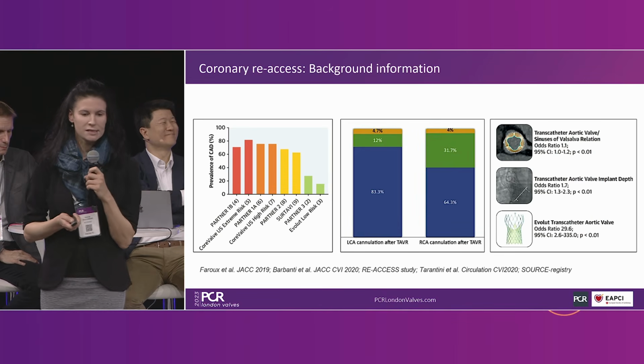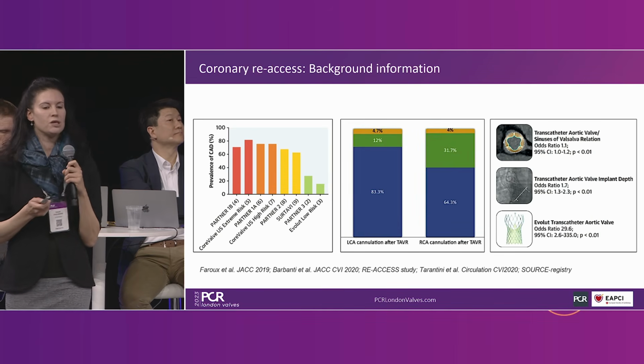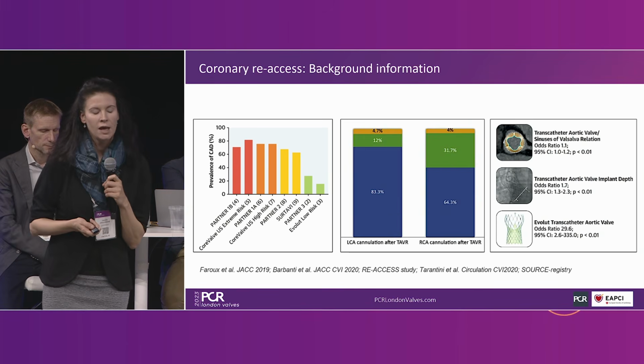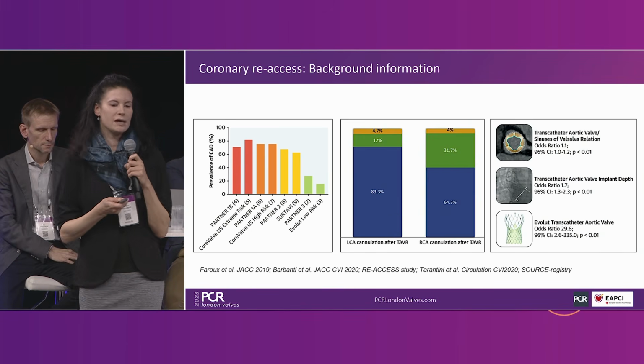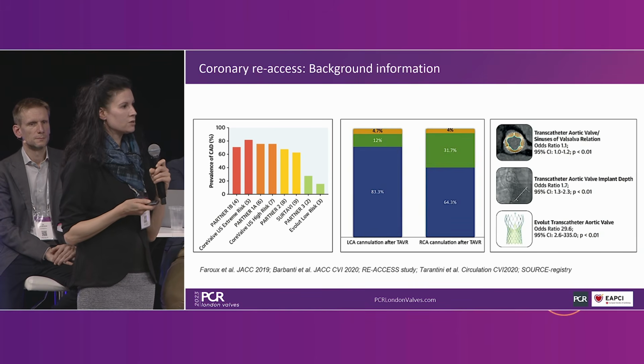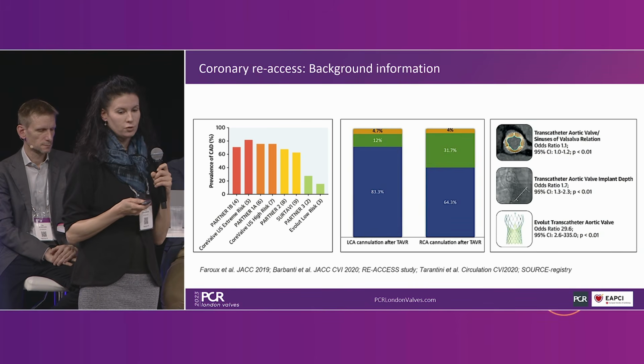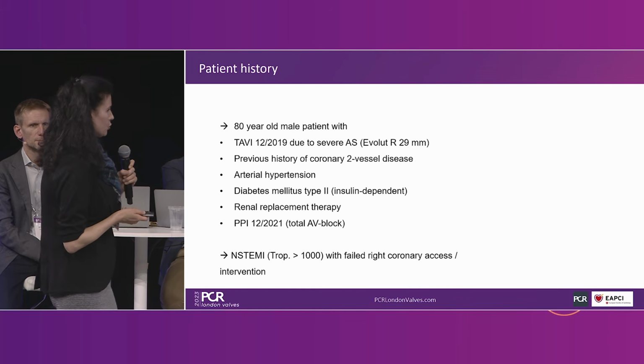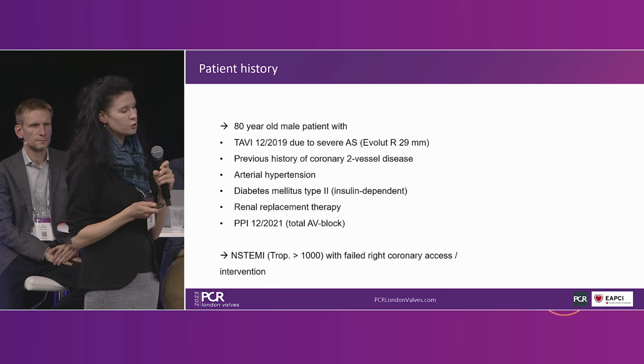And in this context, especially a very close THV to sinus relation, a very high implantation depth, and the use of an Evolut device were shown to be independent risk factors for unsuccessful coronary re-access. And the case I'd like to present to you exactly fits into this setting.